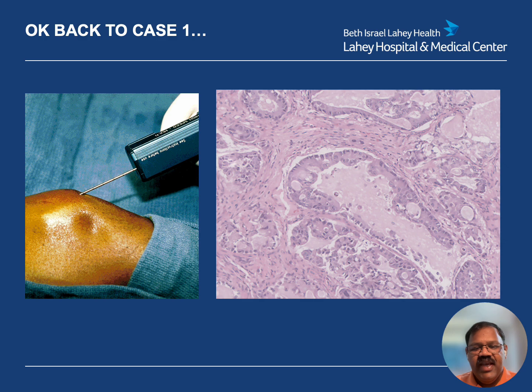Okay, with all that being said, this is what we ultimately did for our patient. Given the soft tissue mass, we elected to move forward with a percutaneous core needle biopsy with ultrasound guidance. And you can see that the fragments of tissue were set for histopathological characterization. On the right side of the slide, you can see an example of the low power view, which based on that, you can see there are many acinar structures and kind of gland-like components. This is highly characteristic of metastatic carcinoma.